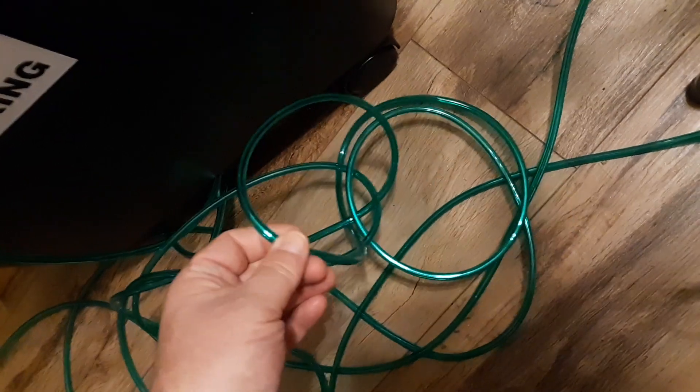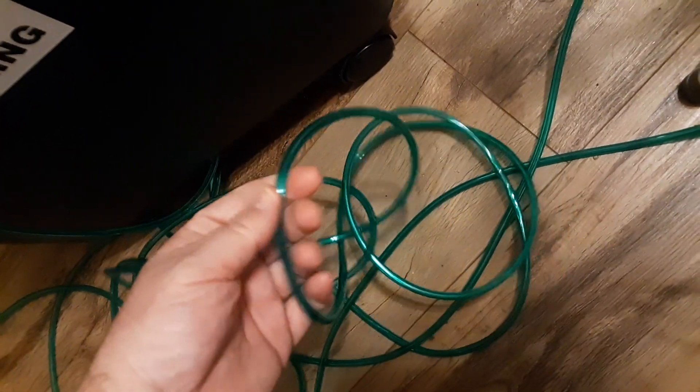You want bubbles to come up at the end, but you don't want bubbles coming up from the line itself. If there are bubbles in the line, there are patch kits available, but I'd recommend getting a new tubing. You can get these on Amazon for very little; I'll put a link in the comment section.